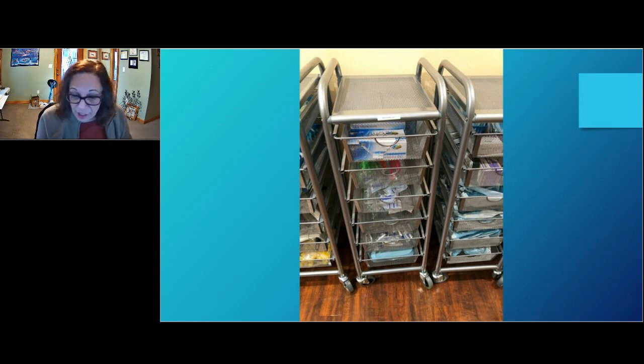However, it doesn't help that if you look here, you see that bottom shelf is very close to the floor. So I had recommended that they empty that bottom shelf, don't use it at all, to help protect the integrity of the other items in the cart, and to replace the items that were in that bottom shelf. Because you didn't know what their condition really was. How clean were they really, being so close to the floor and with people walking by kicking up dust and debris all day.